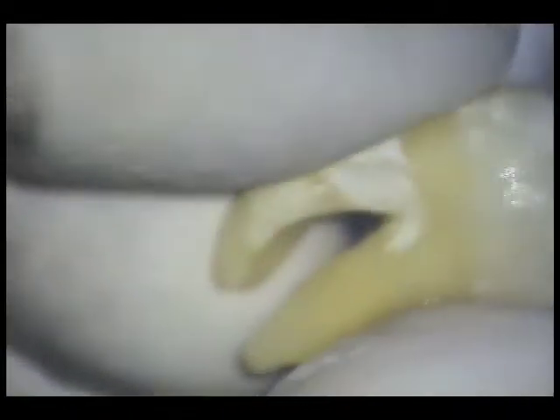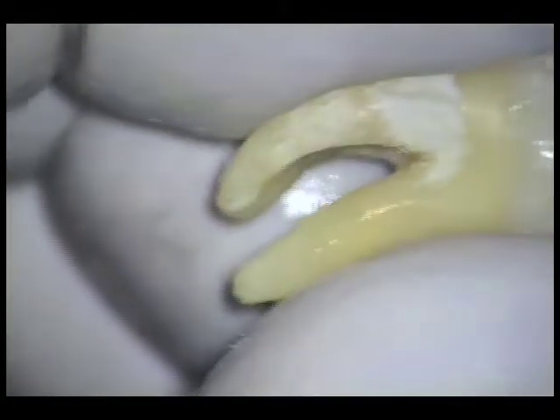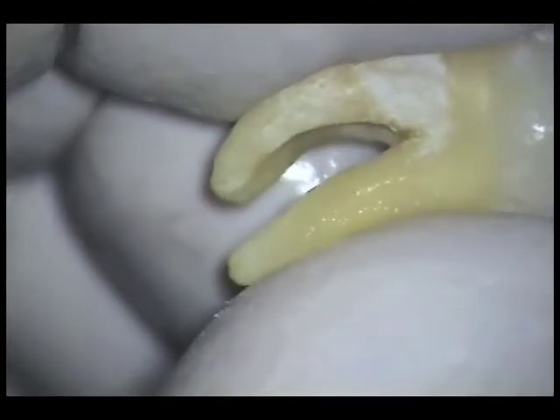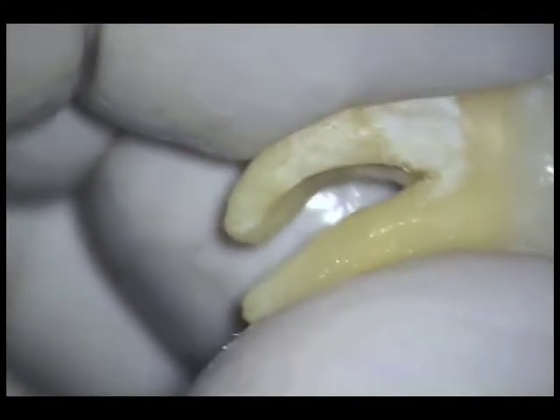Here you see me negotiating a highly curved mesio-buccal canal of a lower molar. It took several watch winding motions to finally reach the apex. At no point is high apical pressure productive. Because I never felt like I was hitting a wall, the most productive motion I could use was a short twist and pull motion.